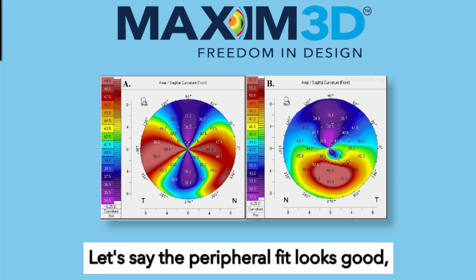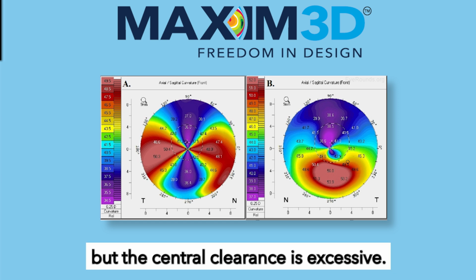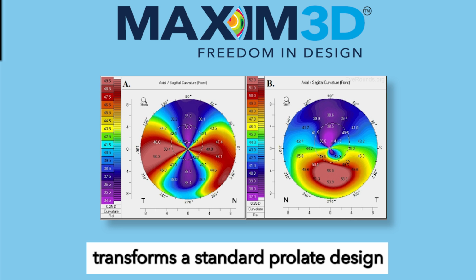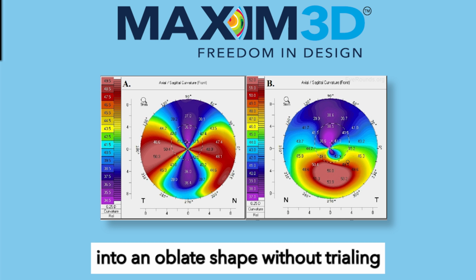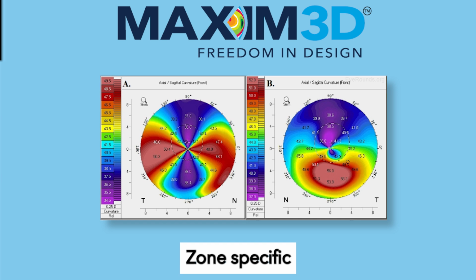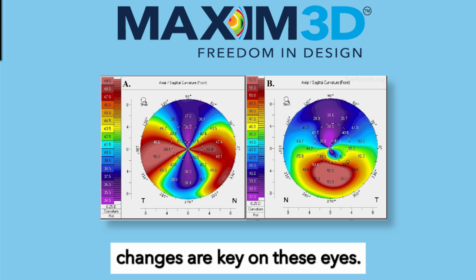Let's say the peripheral fit looks good, but the central clearance is excessive. Flattening the base curve reduces central sag, bringing the lens closer to the cornea. This adjustment transforms a standard prolate design into an oblate shape, without trialing multiple lenses or changing the landing zone. Zone-specific changes are key on these eyes.